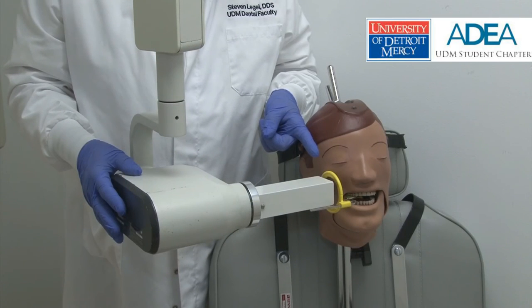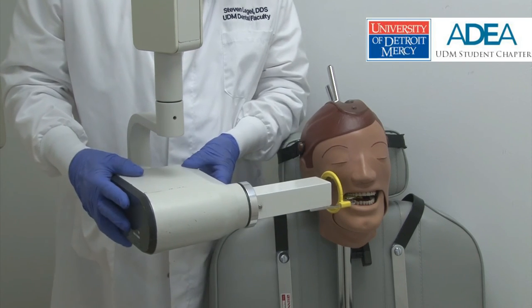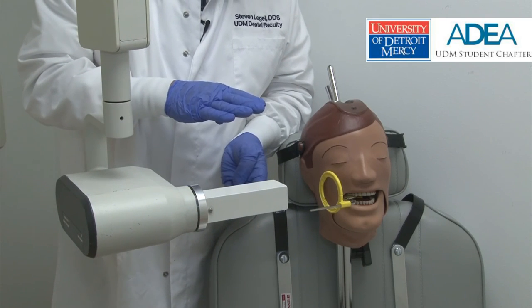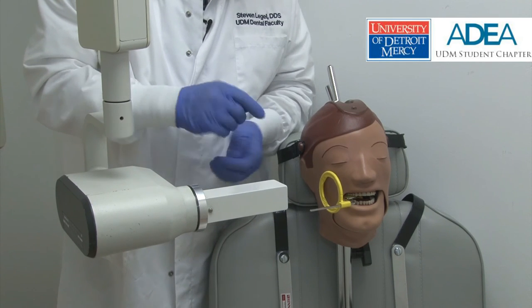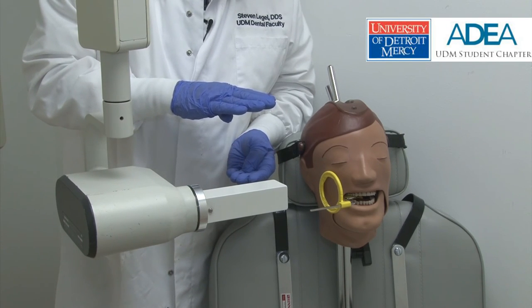The orientation ring is located close to the patient's face. This minimizes magnification error. As the particles leave the edge of the collimator, they spread in a fan-shaped cone. The further the cone from the object, the wider is the pattern of spray. The particles hit the sensor on an angle, and the image of the tooth is enlarged. The enlargement can be so great that the image of the tooth exceeds the size of the sensor to accommodate it.